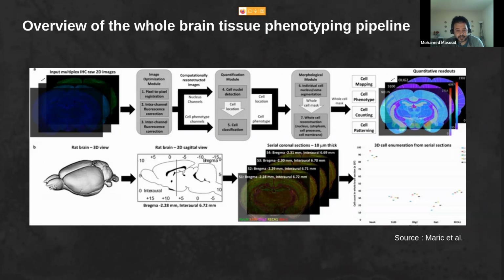From there, they make a batch of slide scanning at 10 microns from a rat brain. These sections get fed in and registered and corrected. Lastly, they work on localizing the cells accurately, and then they try to classify these cells.